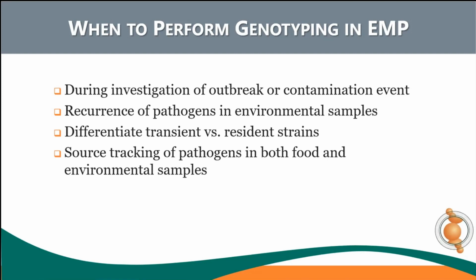A food processing facility may detect food pathogens in both food and environmental samples, and you may want to know where the food is contaminated. There you can use genotyping for pathogen source tracking.